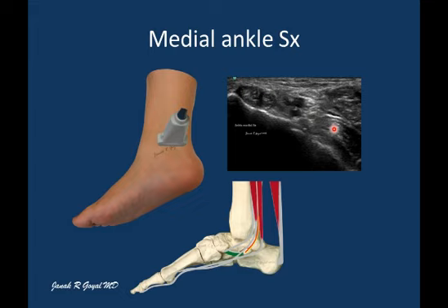Now examine a very important relationship of these tendons to sustentaculum tali. The tibialis posterior tendon lies dorsal to sustentaculum tali, and the flexor digitorum longus tendon is immediately superficial, and the flexor hallucis longus tendon is located plantar to sustentaculum tali in a bony groove of calcaneus.